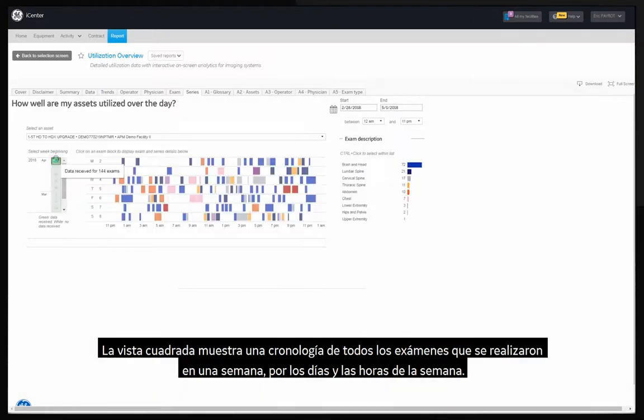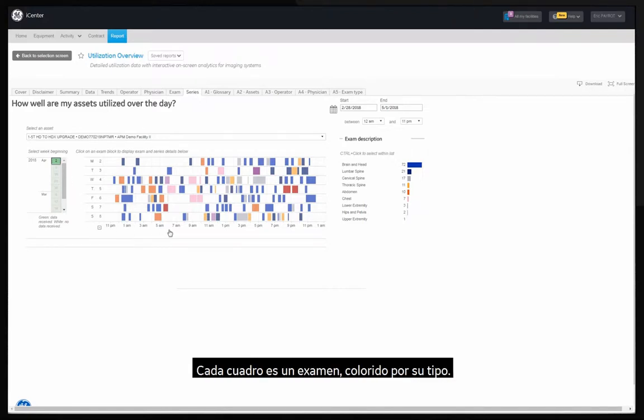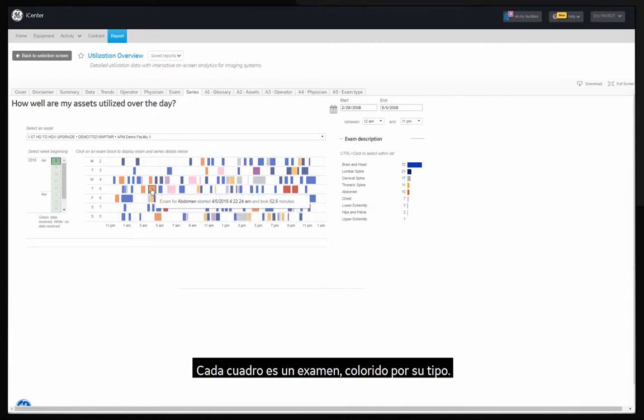The block view shows a timeline for all the exams that have been performed in that week by day of the week and hours of the day. Each block is an exam colored by type.